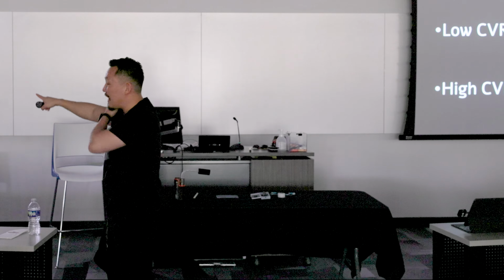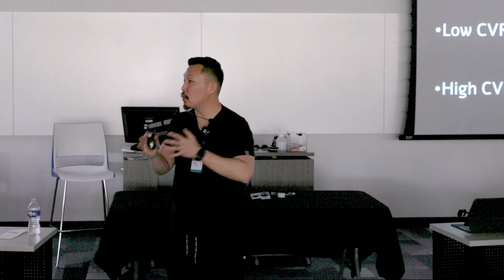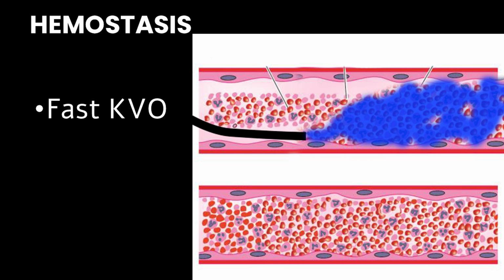If you want it to last, you need to put in the smallest possible catheter for the most appropriate treatment. All right, so just keep that in mind. This is what's happening. That's why the bigger catheters are clotting and failing.